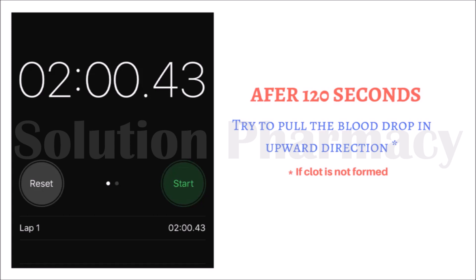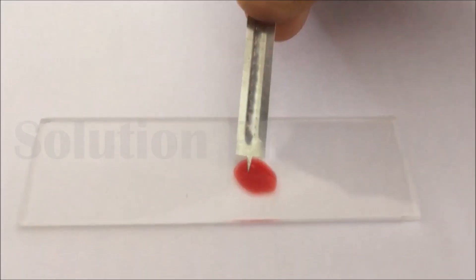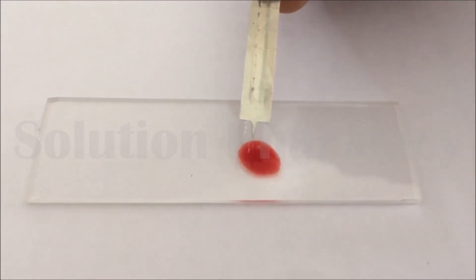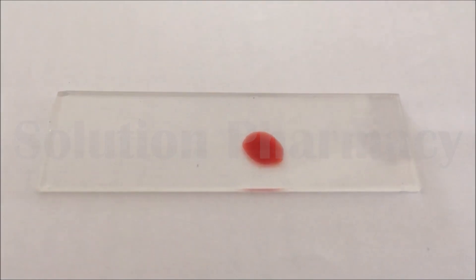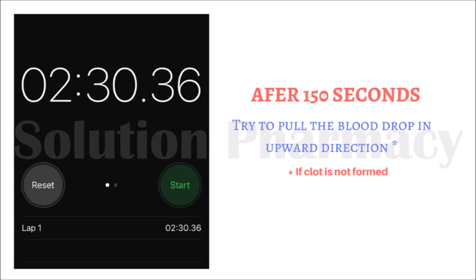If there is clot formation, you can observe formation of thread-like structure, that is the formation of fibrin thread. After 120 seconds, clot is not formed.